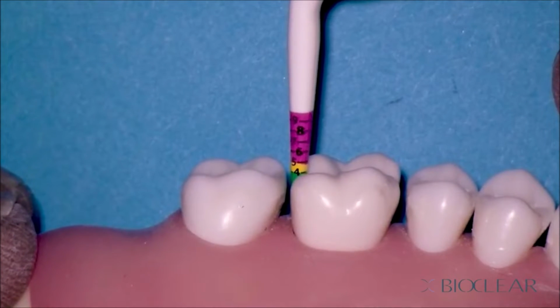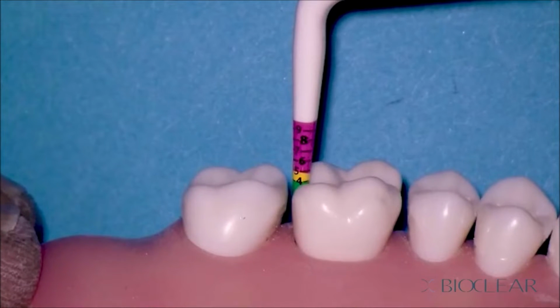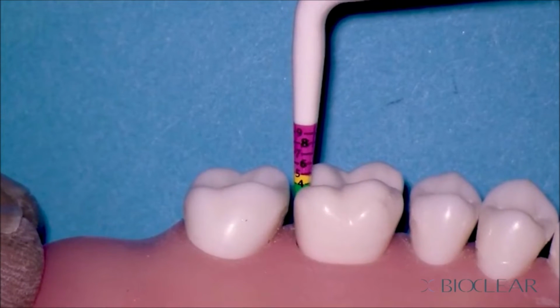So this is absolutely a go. It's in the green zone. We will not need to layer. So we can injection mold with one shot on the distal. What we're going to do to select the height of the matrix is once you've measured the cavity preparation, look at your references, we obviously want the matrix to go by the edge of the prep by at least 1 millimeter or 2 to get a great seal.